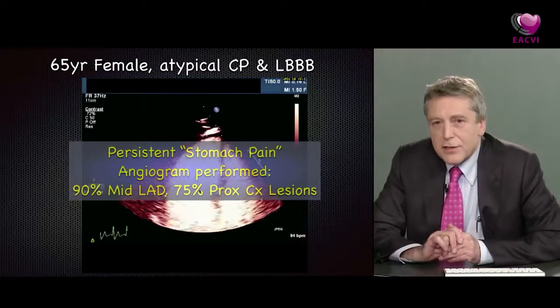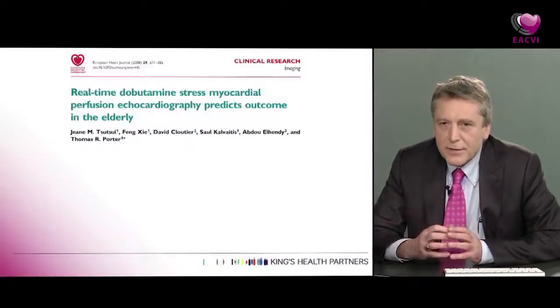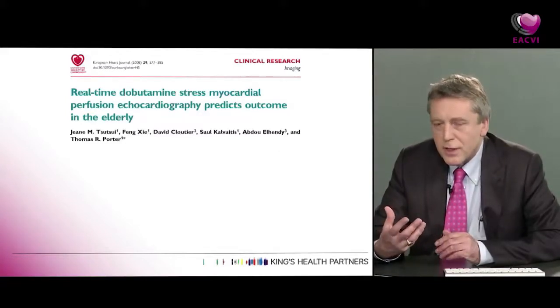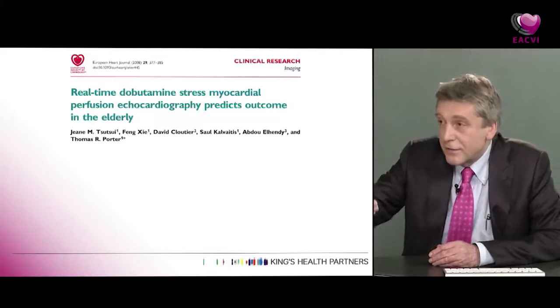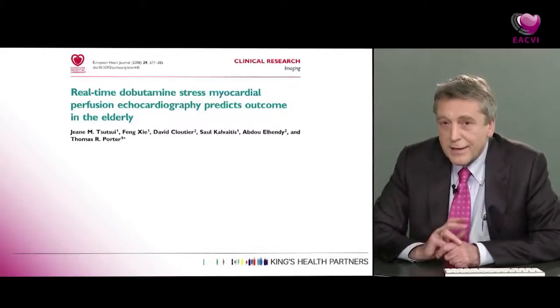So I think I'd like to show this particular paper, because again, it's one of many, and I know that you've published in this area as well, Roxy, that highlights the fact that stress echocardiography, when you're using contrast and looking at myocardial perfusion, doesn't just assist in our diagnosis of reversible ischemia, but it also gives us outcome information. And of course, that's very important these days.